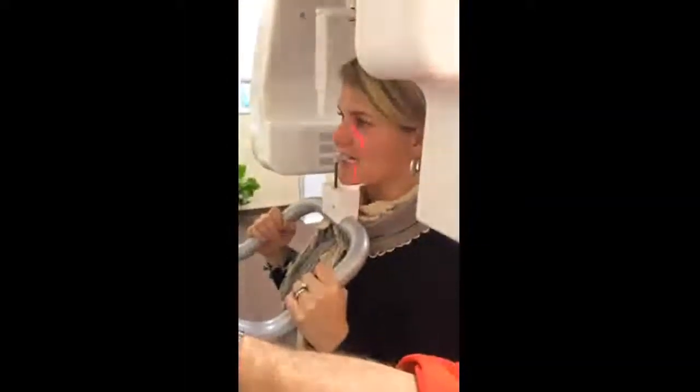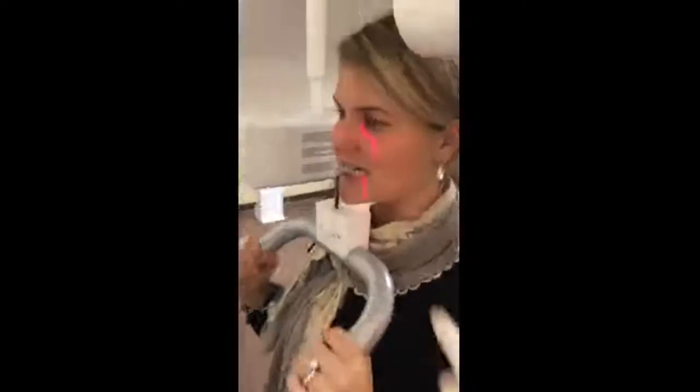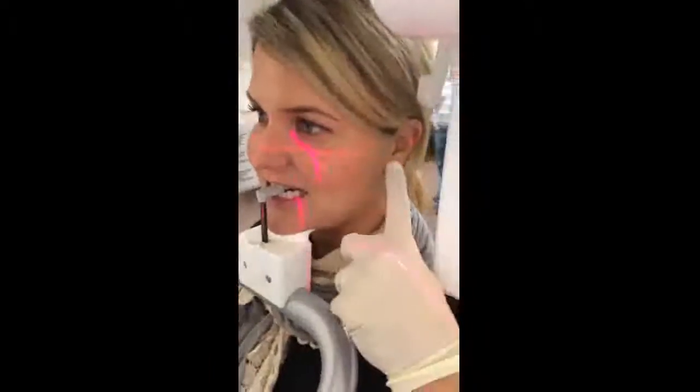Hold the back of your patient's head lightly and lower their chin until your light is at the top of the tragus. So your infraorbital notch to the top of the tragus. Lastly, ask your patient to smile big and make sure that this light is touching the maxillary canine.